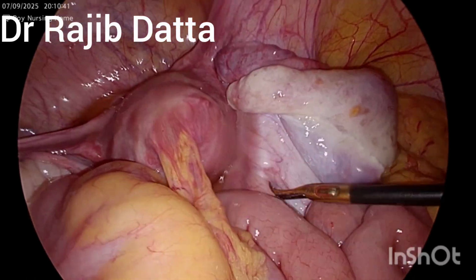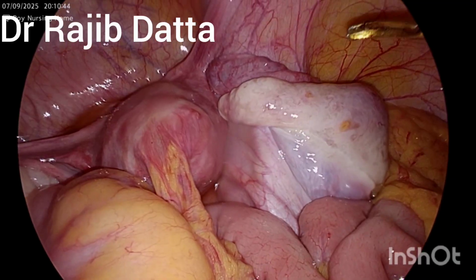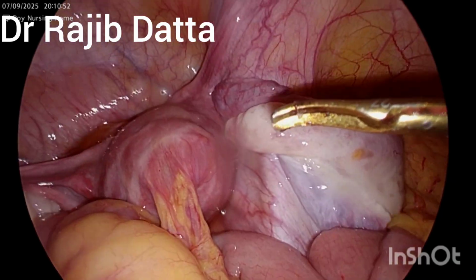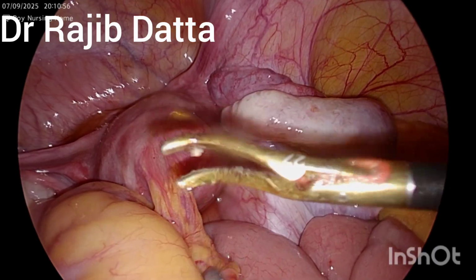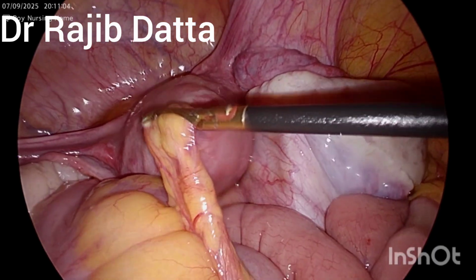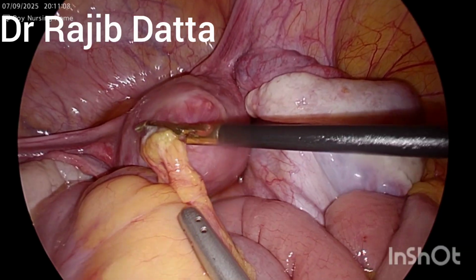So this fundal fibroma that was probably operated on initially during the cesarean section creates some scar, and this adhesion will jeopardize the life of this patient.